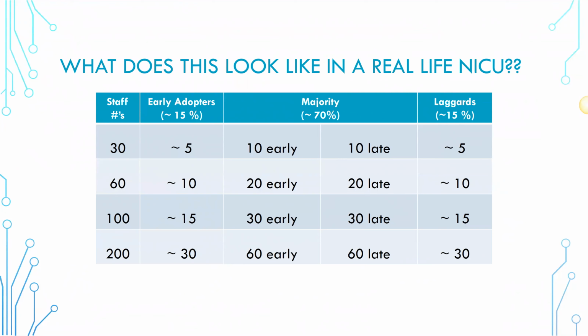When to place the sensors. To me, if you have a baby who's at risk for brain injury, at risk for seizures, putting on the aEEG is just like putting on a heart rate monitor for a baby upon admission. So it's as quickly as possible. And again, based on just your resources in your hospital, you need to decide how quick that is. And it could be something that you could potentially monitor as a quality indicator as your program is developing. But certainly time is brain. And if you're concerned, it's important to get this going as quickly as possible.